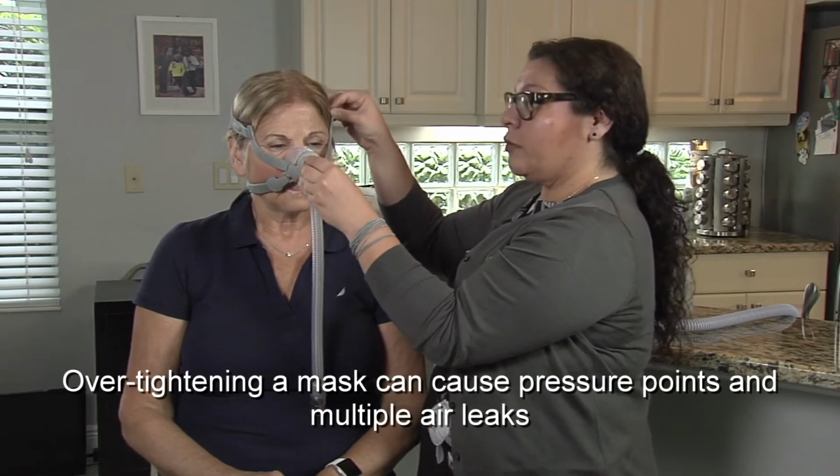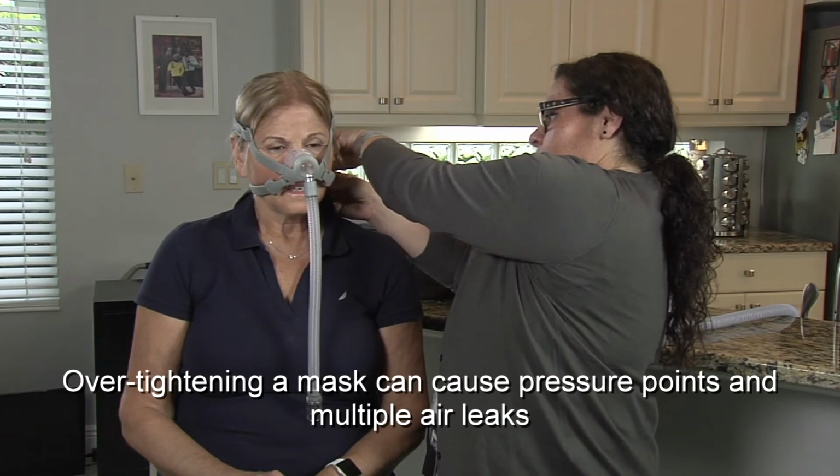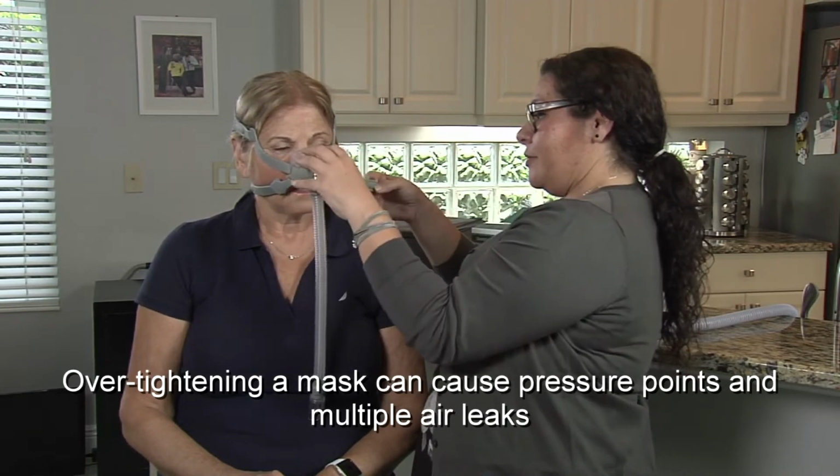Adjust, but do not over-tighten, or you can create pressure points and excessive leak. Sorry if I'm pulling your hair.